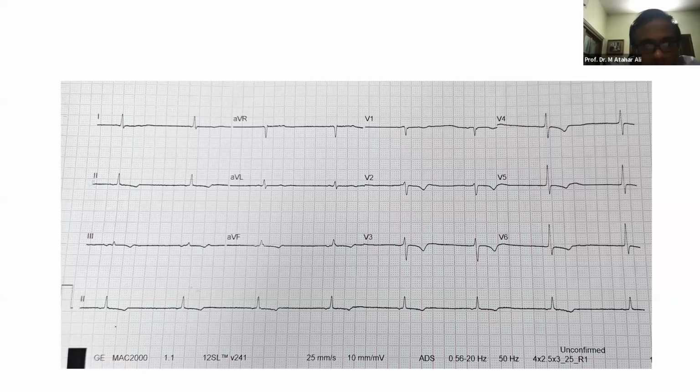Shafique, I want to know the scenario. The patient was brought conscious, and probably then verapamil was given and arrest developed. Then CPR was given and the patient intubated. Probably they gave CPR for around 15 minutes. So they did not try adenosine, no? Because the patient previously got verapamil, that is why they chose verapamil first.